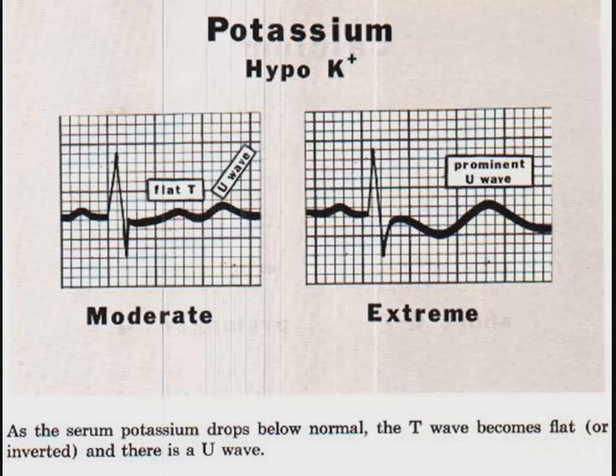And in this case, there is something called a U wave. I will never ask you anything about the U wave.